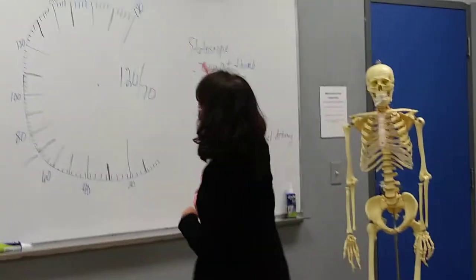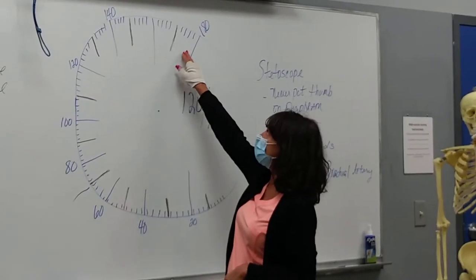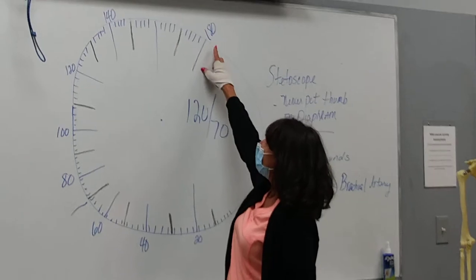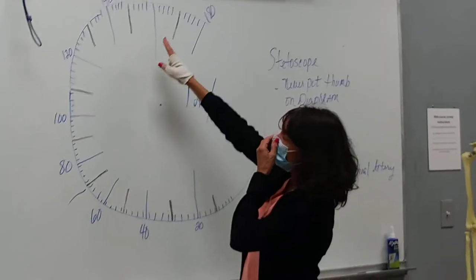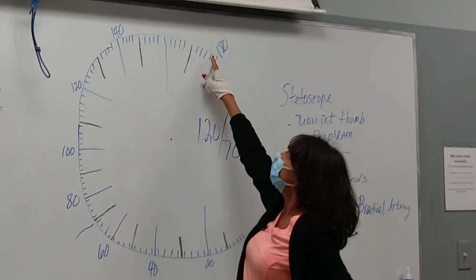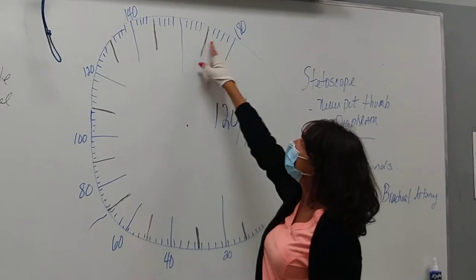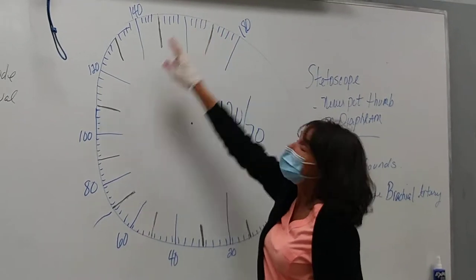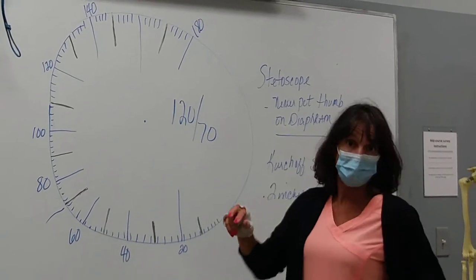On our sphygmomanometer, we've got our dial, which is always in 2 millimeters of mercury. And reading the blood pressure cuff, you'll pump it up after you get a peak obtained. So 180, 178, 176, 174, 172, 170, these are by 10s, and then these would be by 20s. And each one of these little lines would go by 2 millimeters of mercury, okay?